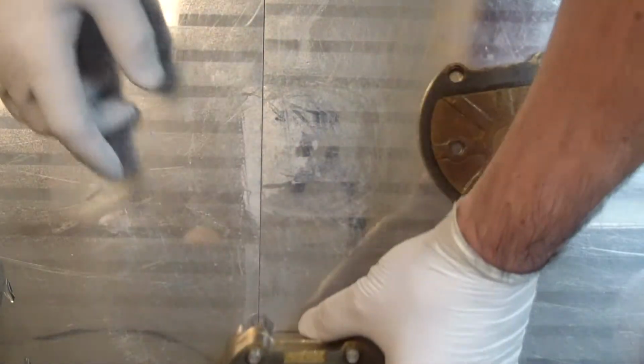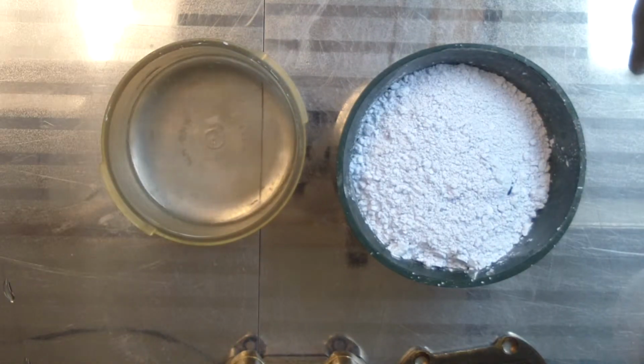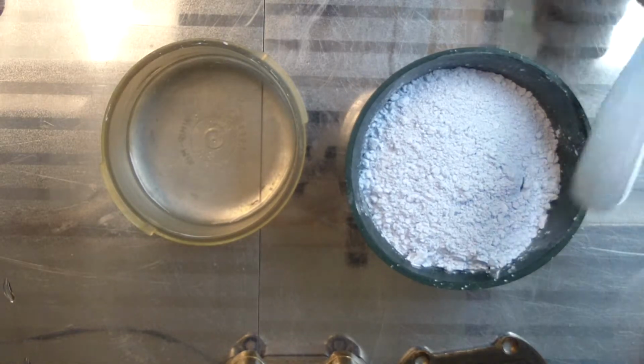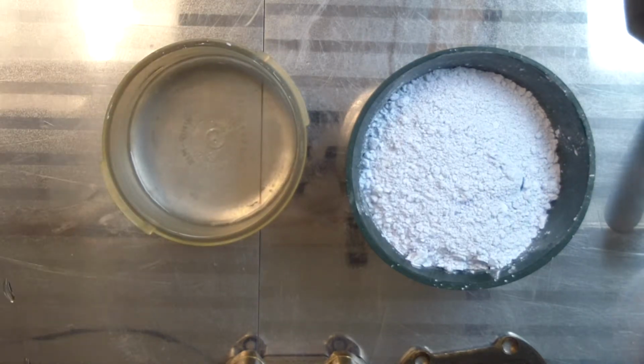So I'll move this out of the way, and I'll show you how I do my second pour. I prefer to pre-weigh and pre-measure my powder and my liquid. The reason for that is because it just creates a more consistent mix, and the closer you follow the manufacturer's instructions, the better results you will achieve. And I like to vacuum mix my stone also because you get much better results. So there's about 300 grams of powder here and about 105 milliliters of water. That's 35 milliliters of water to 100 grams of powder.